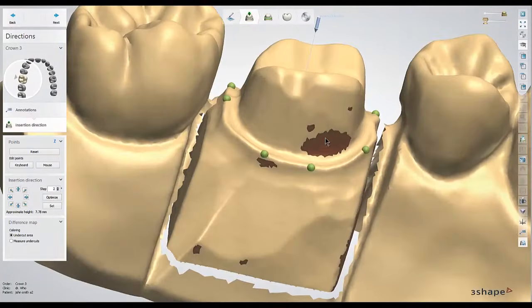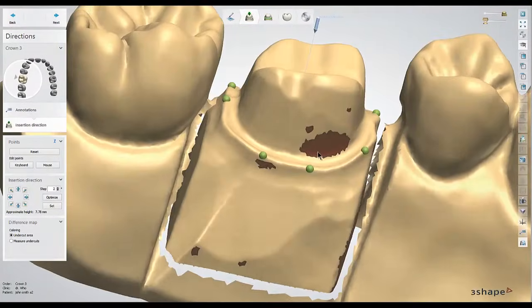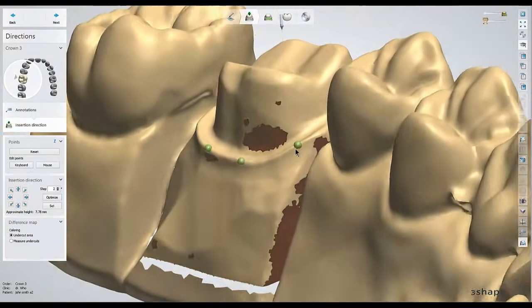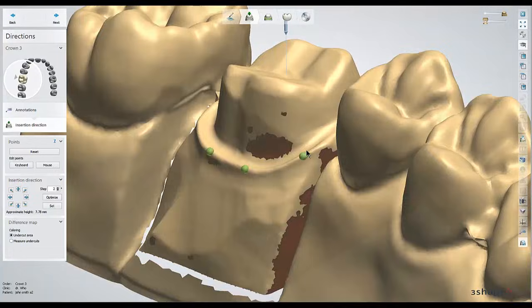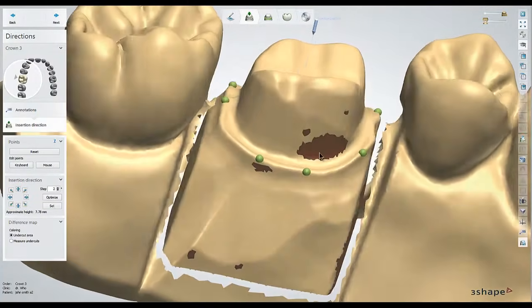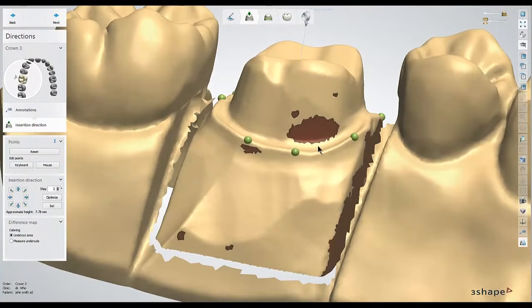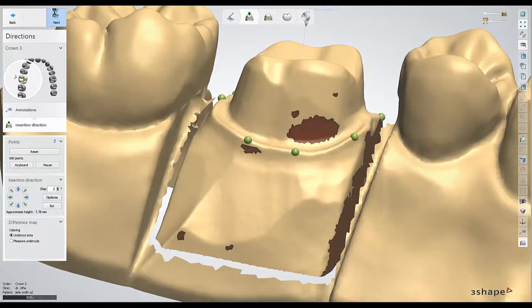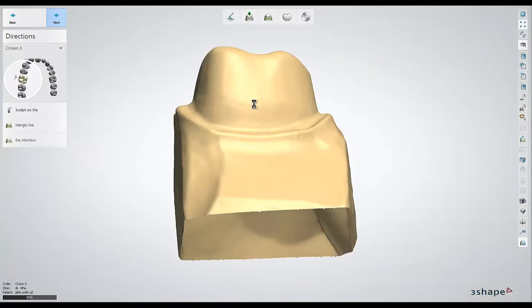It's okay to leave behind undercuts as long as they aren't directly on the margin line, since all of these red areas are going to be automatically blocked out. As long as the margin line is free of those red highlights, we'll continue next.